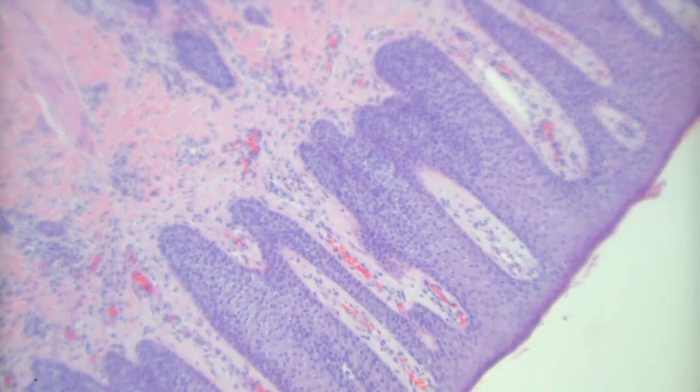They biopsy weird lesions like this, and they want us to help them distinguish between the two. And that's the best way to do it, is to use the architectural features, look for suprabasilar mitoses, but sometimes there's some conflicting criteria if there's a lot of secondary inflammatory changes in it. So this was psoriasis that had spongiotic dermatitis with it. If you see biologic psoriasis, sometimes it kind of looks like this too. It's usually a little bit more blunted without the prominent spongiosis.